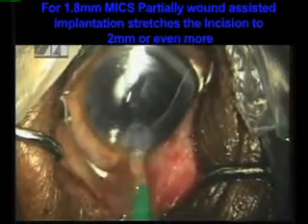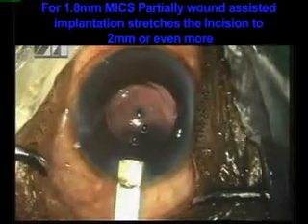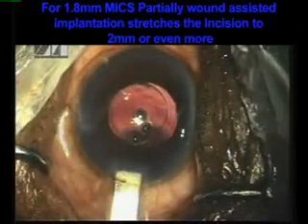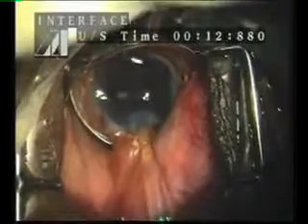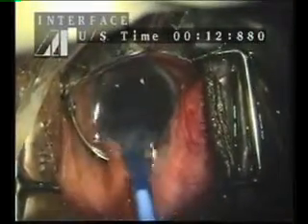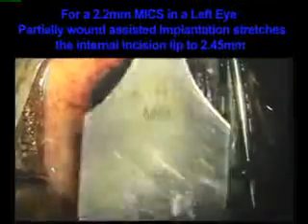Due to this maneuver of the distal tip end of the micro cartridge, the passive incision size of the internal lip of the 1.8 mm micro incision stretches to 2.05 mm or 2.2 mm. In the case of a 2.2 mm micro phaco incision, due to this maneuver of the distal tip end of the micro cartridge, the passive incision size of the internal lip of the arcuate corneal valve stretches to 2.4 mm or 2.45 mm when implanted in a partially wound-assisted manner.